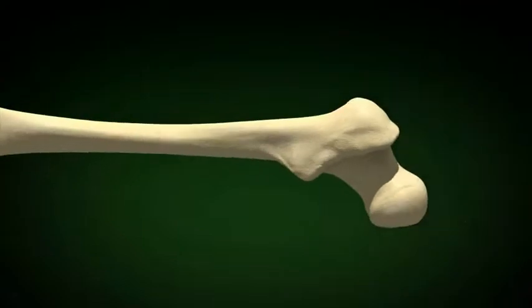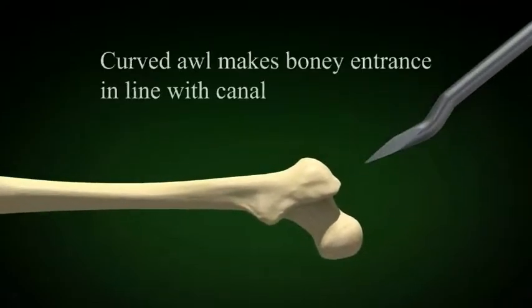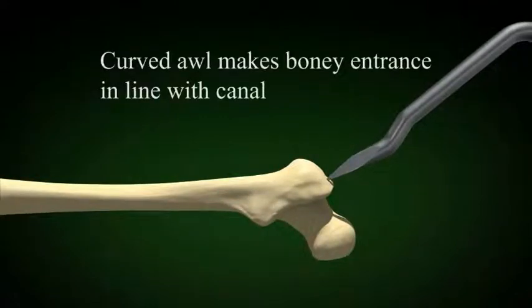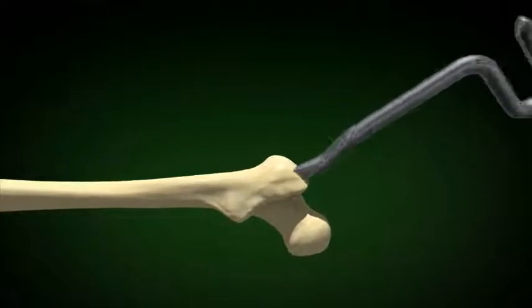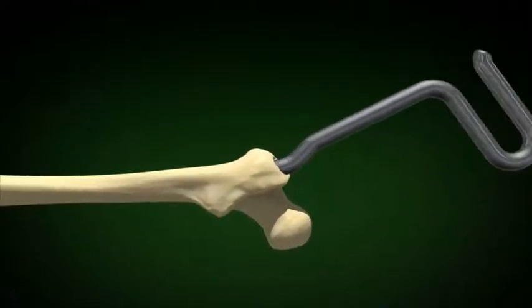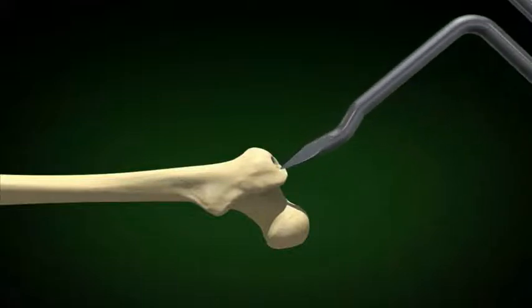This femur does not have the usual anterior bow. The hole is made using a curved awl. Look at the curve of the awl to be sure you don't penetrate the cortex distally.